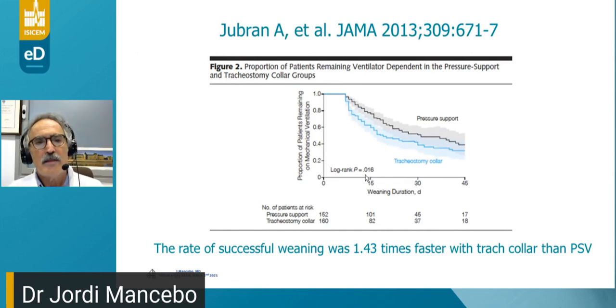In patients with prolonged weaning, the most difficult to wean, most of whom are patients with tracheostomies, in this very specific subgroup of patients, the most efficient strategy to reduce the duration of mechanical ventilation is the disconnection from the ventilator with a tracheal collar at least once per day, as compared to a progressive withdrawal of mechanical ventilation.